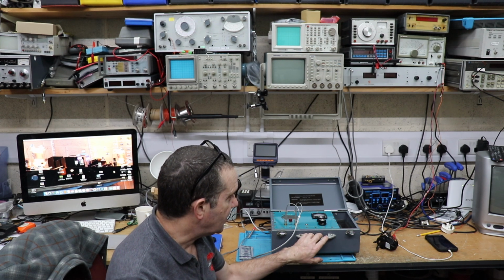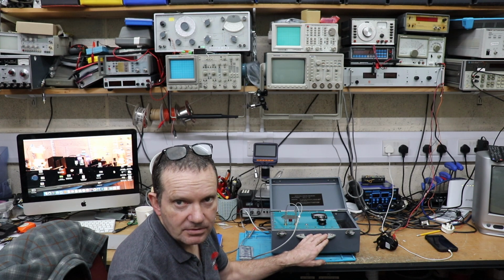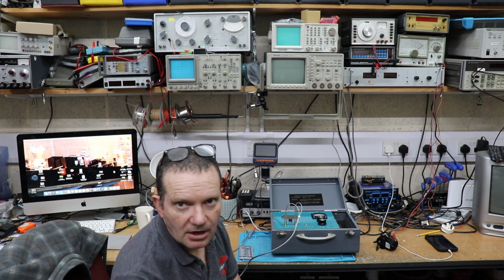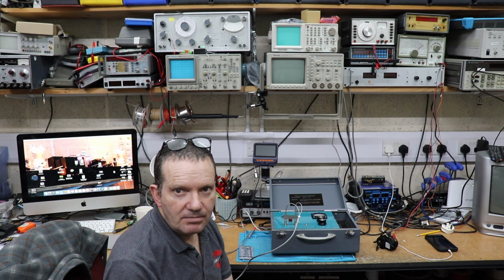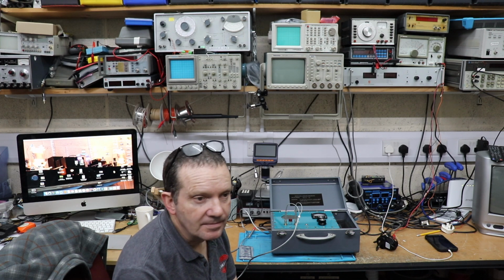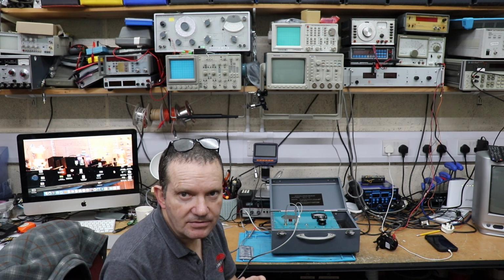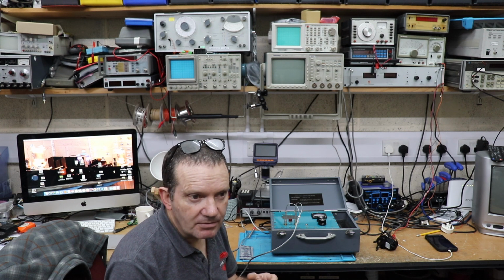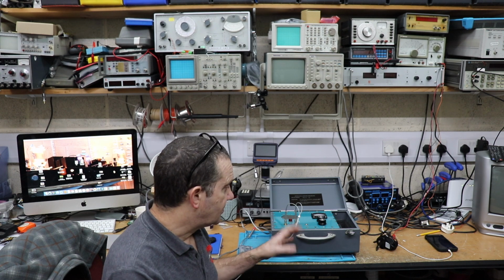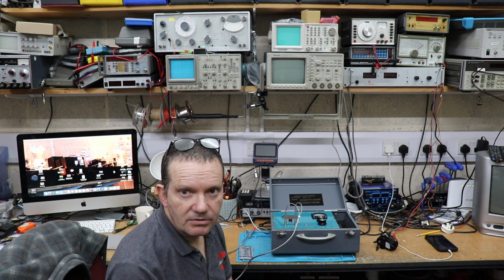And this machine basically uses some piezoelectric crystals in the probe to emit some ultrasonic waves, which bounce back off the moving blood in the artery, or whatever vessel you're probing. That signal is then received by another crystal in the probe, and then it's amplified, and what you hear is what comes out of this particular unit, or whatever unit you're using.